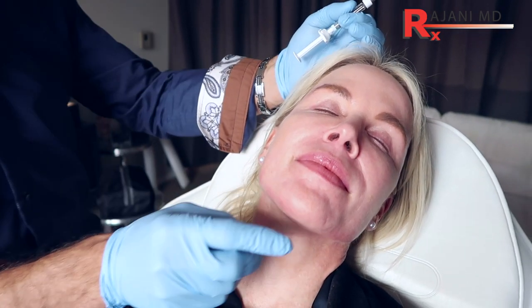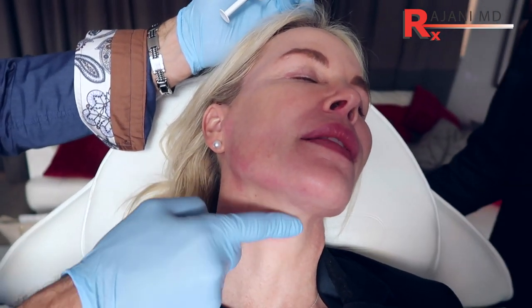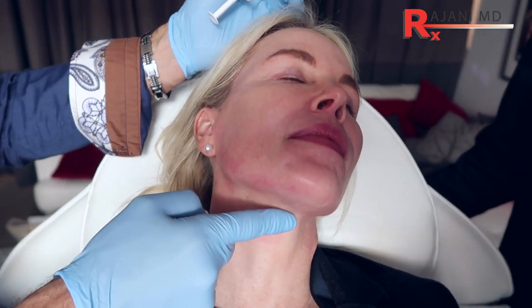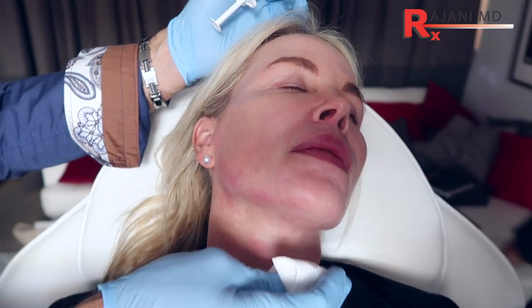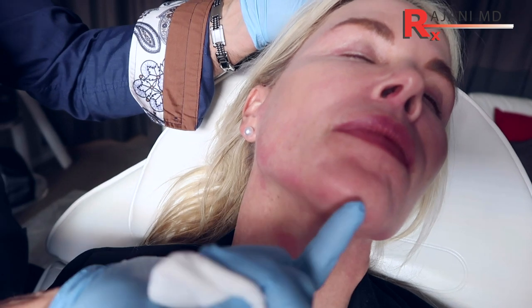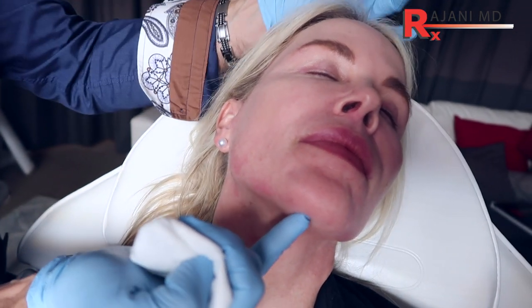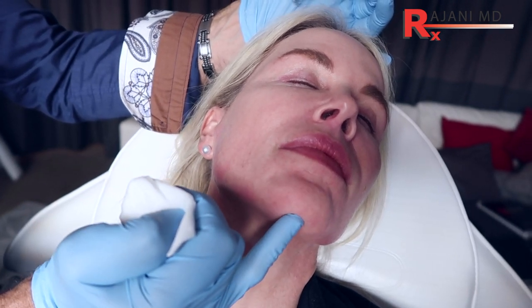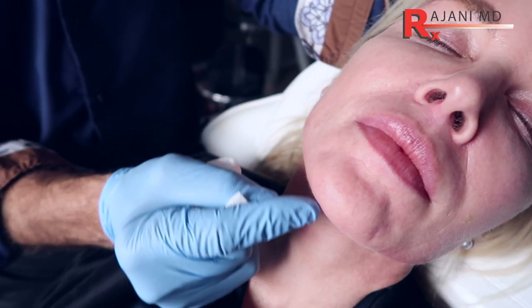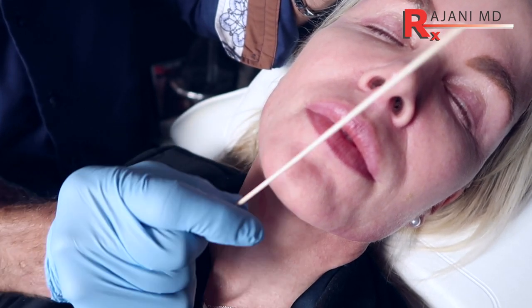So the jawline, which we often fill in the preauricular area, sometimes the cervical mental angle isn't as strong. I'll take a straight edge and show you the line we look at from the chin and the nose. Sometimes we can gain by adding a little bit of volume forward on the chin, as well as adding some length here, and that helps us add a little bit of length and a more beautiful angle on the jaw.